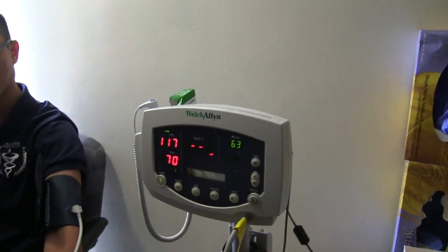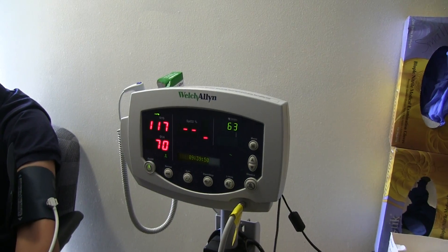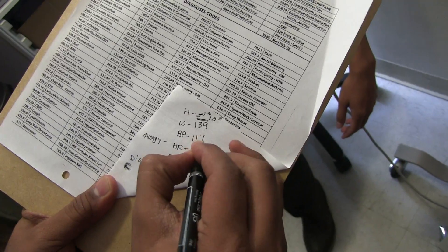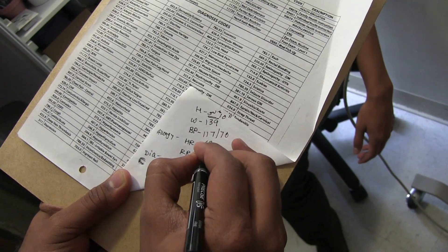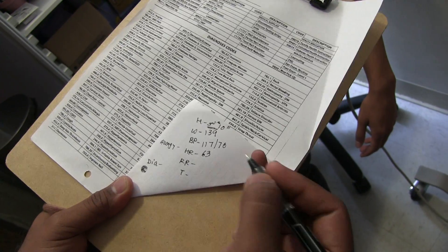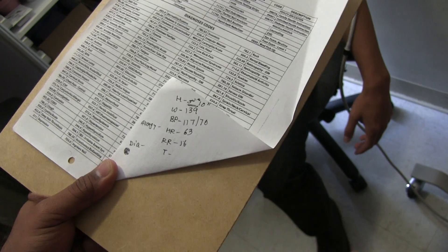Here you can see the blood pressure reading. I'll write down blood pressure 117 over 70. Their heart rate shows 63. For the respiratory rate, I counted about four breaths in 15 seconds, so multiplying by four gives 16 breaths per minute.